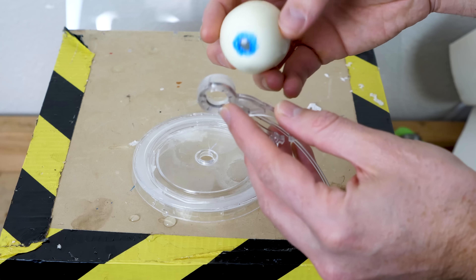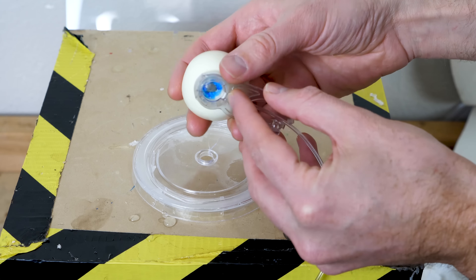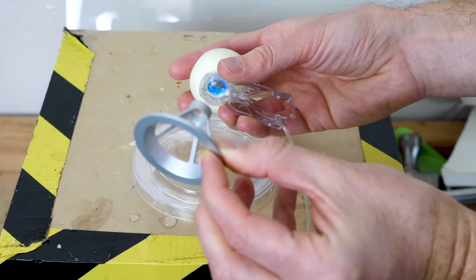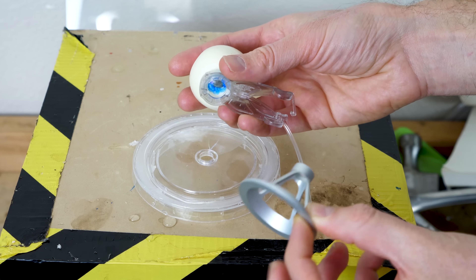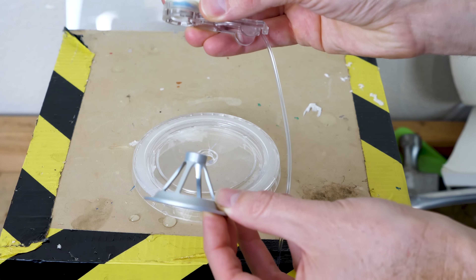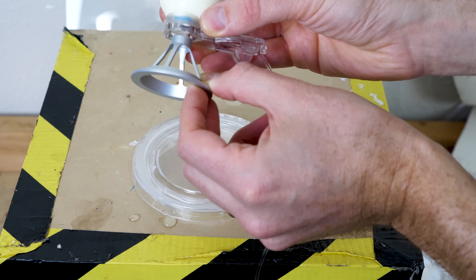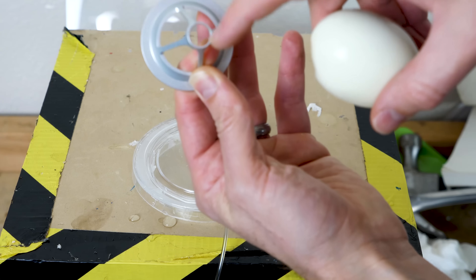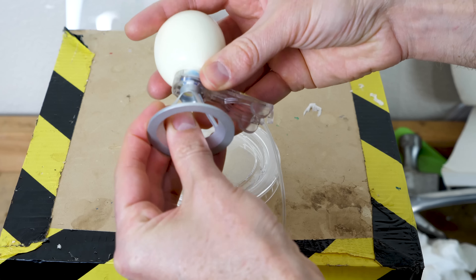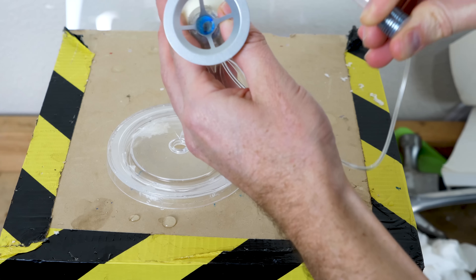First they stick this thing on your eye — it has kind of a suction cup on it and it goes right over your iris. Then they put you in a different chair and this piece is hooked to a machine that has a laser on it. This piece has to dock together, so your eye is on it like this, and this piece comes over and docks down. It has a hard glass lens on it right here, and it gets pushed right up against your eye.